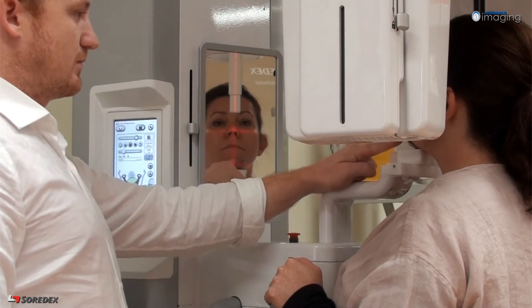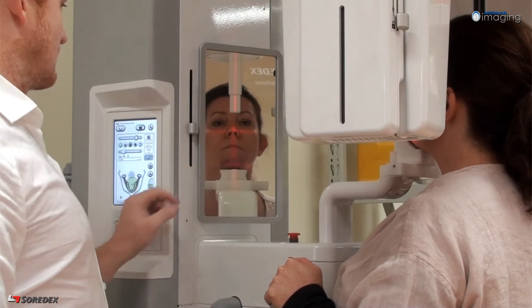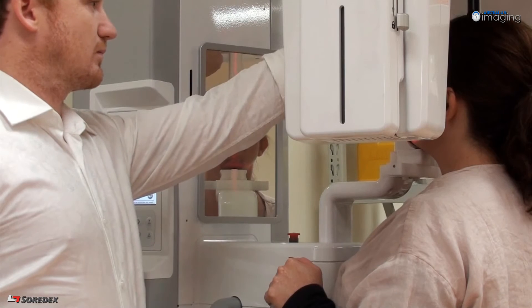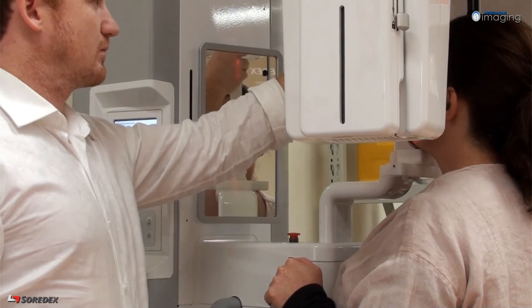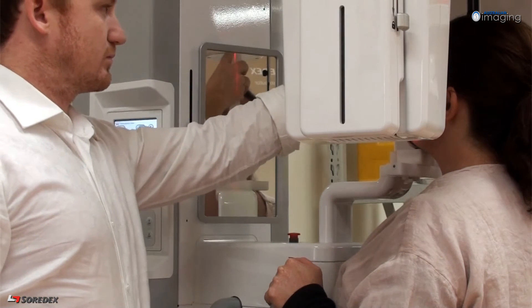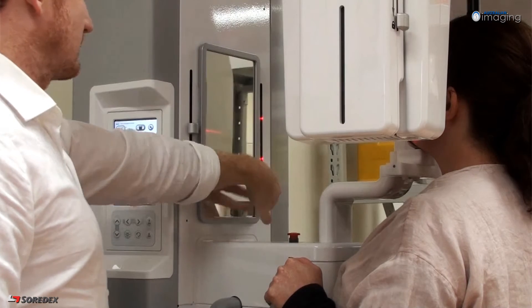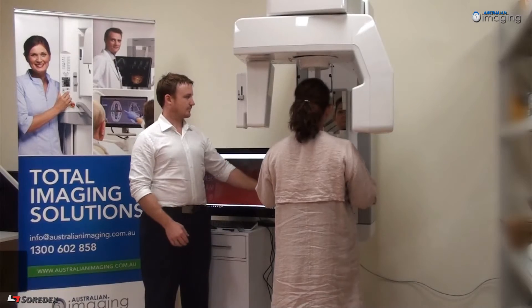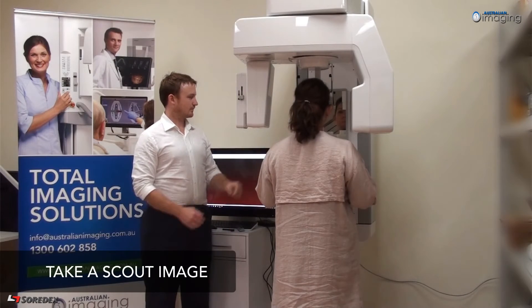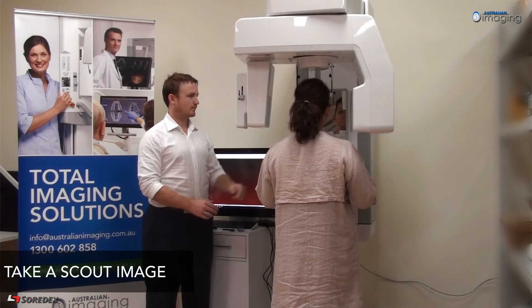Bring the headrest into position and close the temple supports. Once you are happy with your patient position, you are ready to take your scout image. To ensure your image is set up correctly, we recommend taking a low-dose scout.